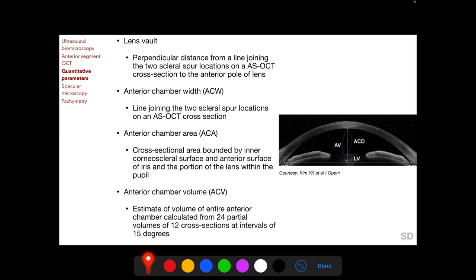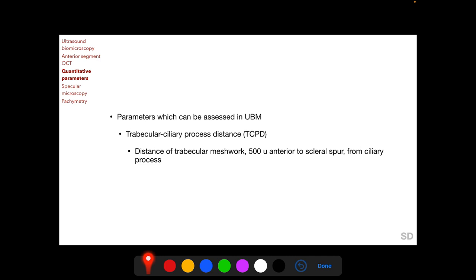Anterior chamber width (ACW) is the length of the line joining the two scleral spur locations on an AS-OCT scan. Anterior chamber area (ACA) is the area bounded by the inner corneoscleral surface, anterior iris surface, and anterior crystalline lens surface within the pupil. Anterior chamber volume is estimated from 24 partial volumes along 12 OCT cross-sections at 15-degree intervals. A parameter measurable only by UBM is the trabecular–ciliary process distance (TCPD), the distance from the trabecular meshwork 500 microns anterior to the scleral spur to the ciliary process — unmeasurable by OCT because the ciliary process lies behind the iris.